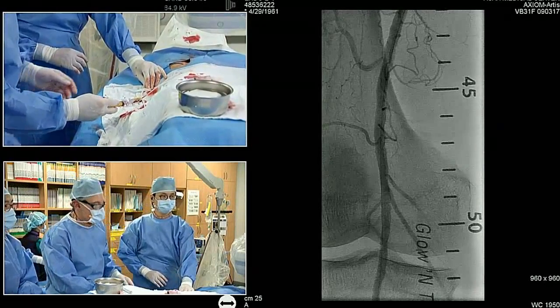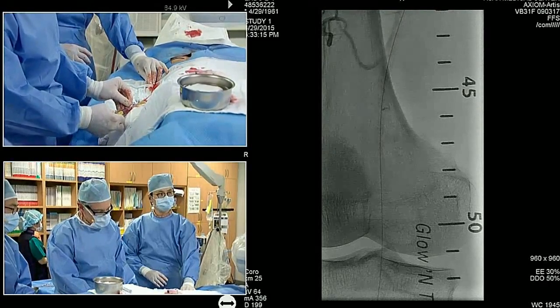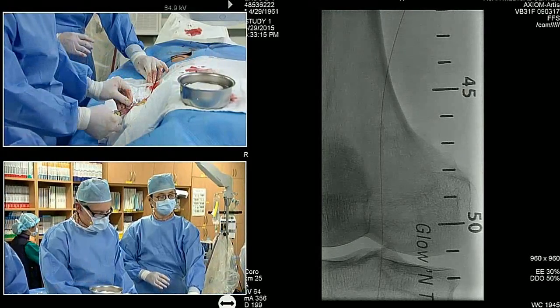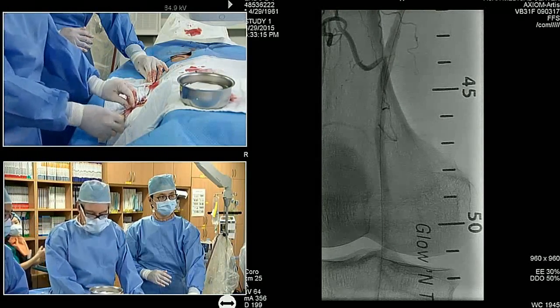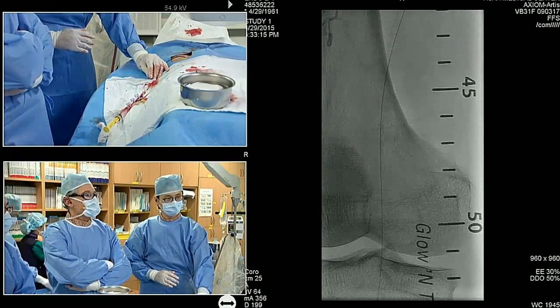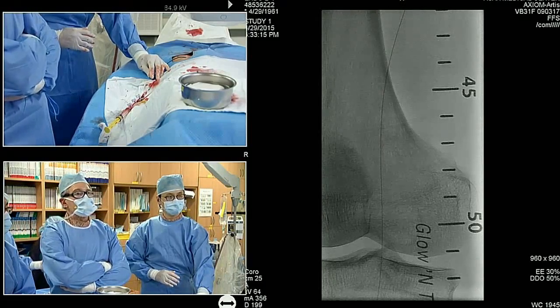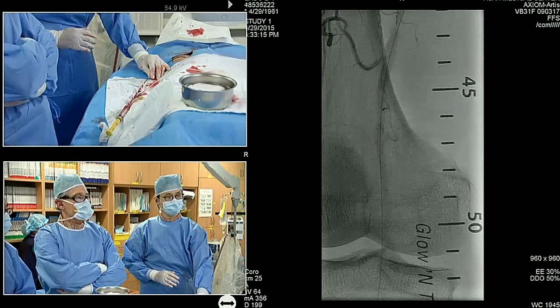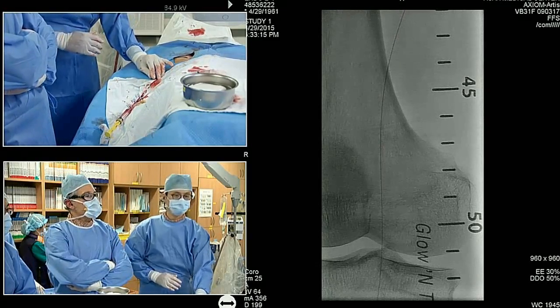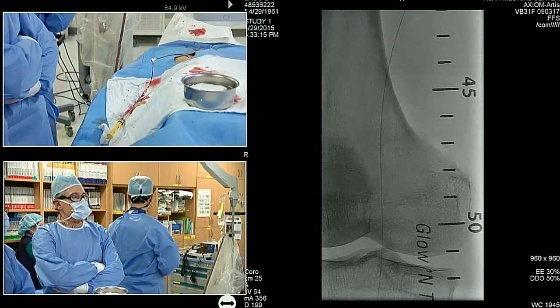Okay, so we're nicely down the distal vessel. It's a big vessel. Seems unusual. So we're going to pre-dilate this. It seems a little unusual that he has a really nice profunda and his ABI was 0.4 with an SFA occlusion. But I think balloon stent makes sense. The alternatives would be, it looks like he crossed pretty cleanly. Yeah, you could just get away with balloon alone, i.e. DCB. As alternatives, but I think if you want to get the rail down there, it probably makes good sense.